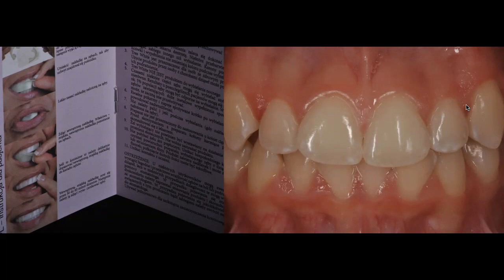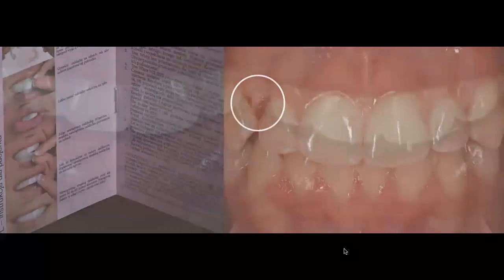I don't have them remove the tray if they see some gel. I just have them clean the gel, but I make sure that they understand that the following day when they're going to use a new tray, they have to be very careful. This is very painful. And again, you don't want your patients to feel that, because this is what's going to push them away from the treatment. And what you want them to do is actually to complete the treatment. So keep that in mind.